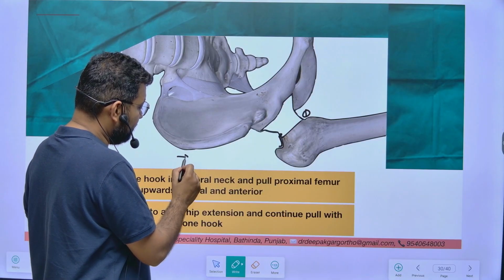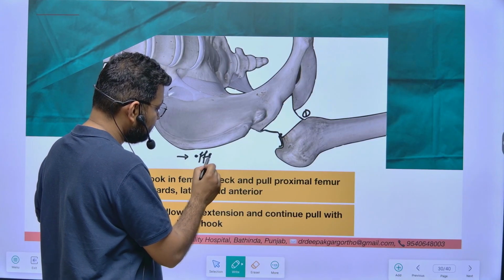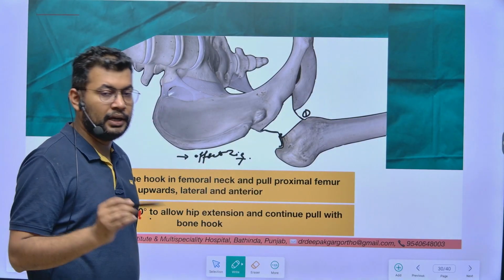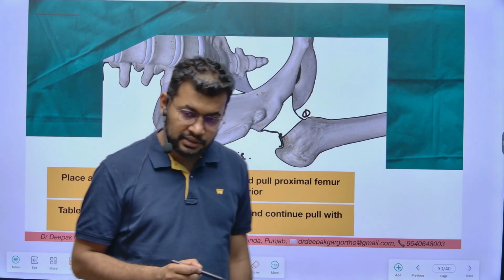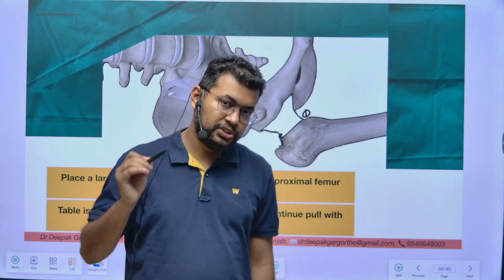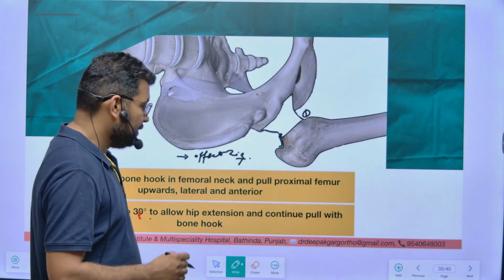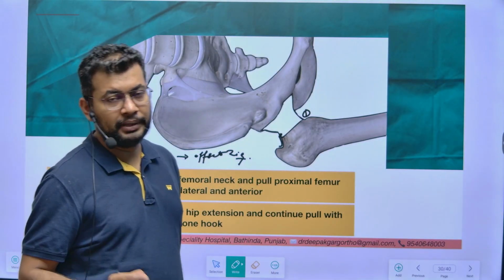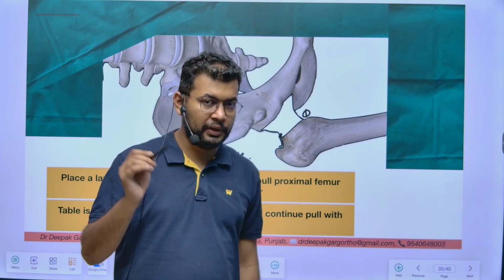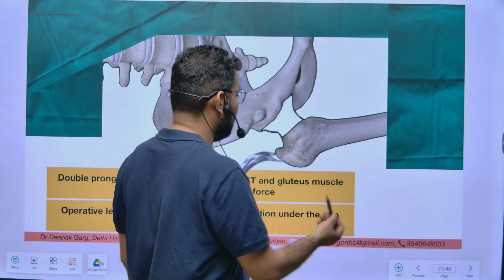One thing that we need to remember for this surgery is please use offset jigs. This is very compulsory. Don't do this with the normal total hip replacement instruments. If you use the normal total hip replacement instruments, there is a very high chance of getting a GT fracture. Please don't do that. If you do not have the instruments for direct anterior approach, please go through the posterior or the lateral approach. Please don't go through the anterior approach. So this is how we do it.